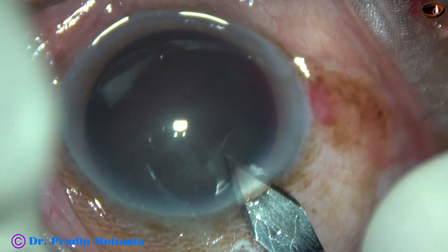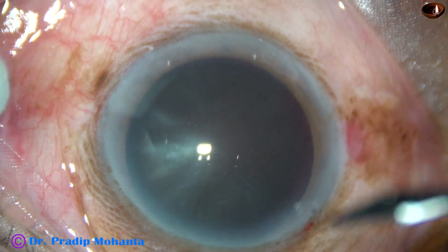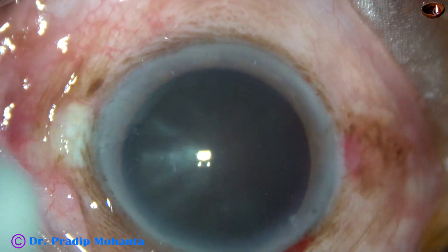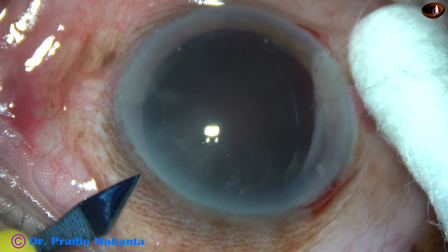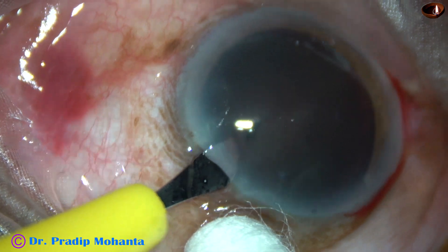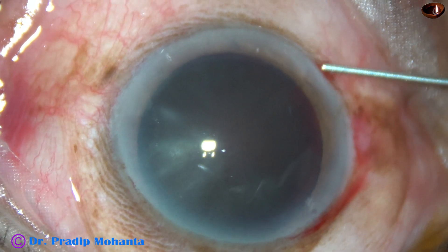This is the main incision with a 2.8 mm steel keratome at 11 o'clock at mid-limbus. This is a side port on the right side of the main incision, and this is another side port on the left side. The side ports are about 3 clock hours away from the main incision.